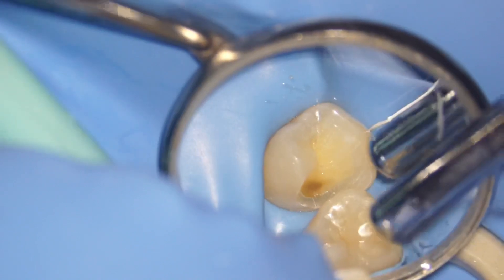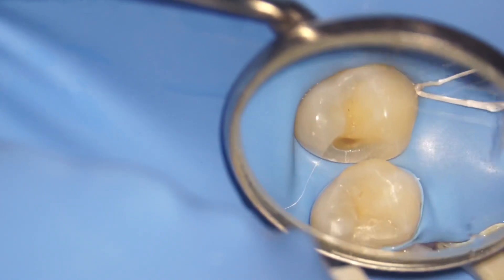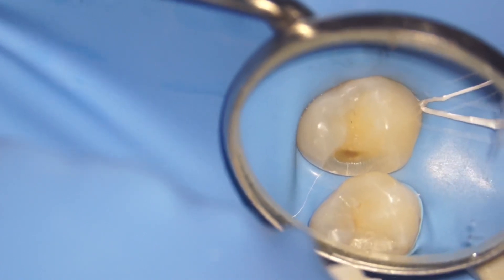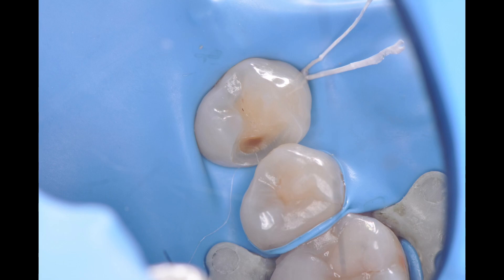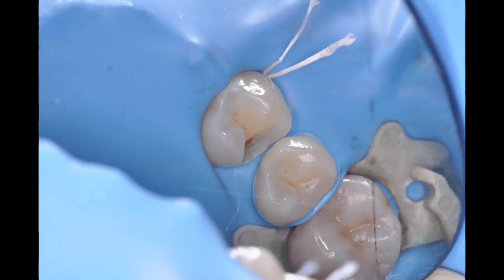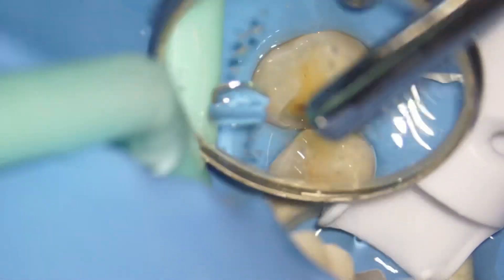For this patient, I had recently done the 1,5 distal and the 1,6 mesial, and I was expecting her to have pain in relation to those two teeth because of some deep caries. But luckily, it was actually this 1,4 that was having pain on percussion.